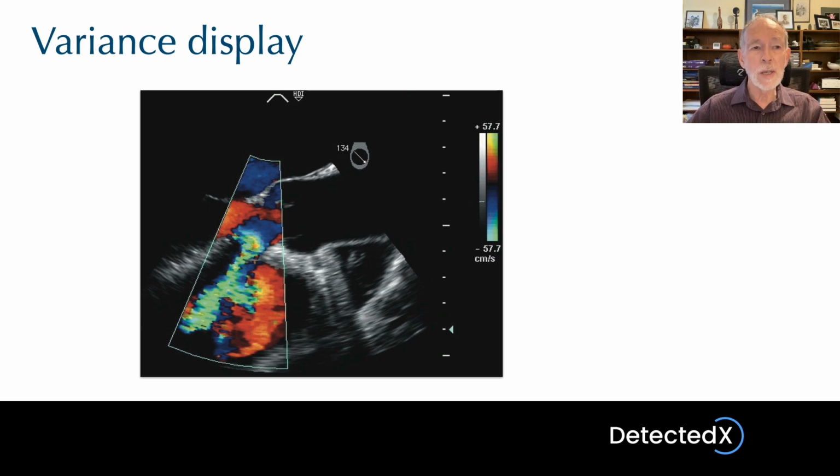I mentioned before the variance, which is one of the parameters Colour Doppler measures. Normally, this is used just internally within the machine to help it determine whether each point is tissue or blood. However, there are times when the variance is actually displayed as part of the colour display, and this is an example of that. Notice, by the way, that the typical convention that's followed with the red and blue colours used to represent the Doppler shift is shown here.